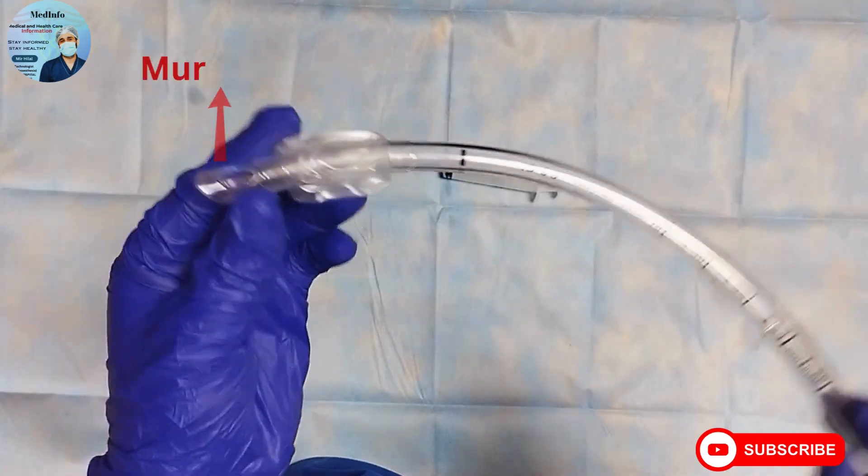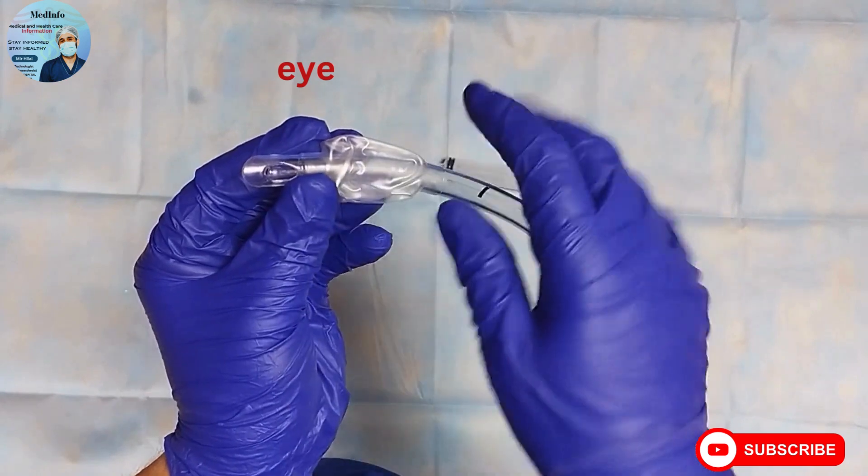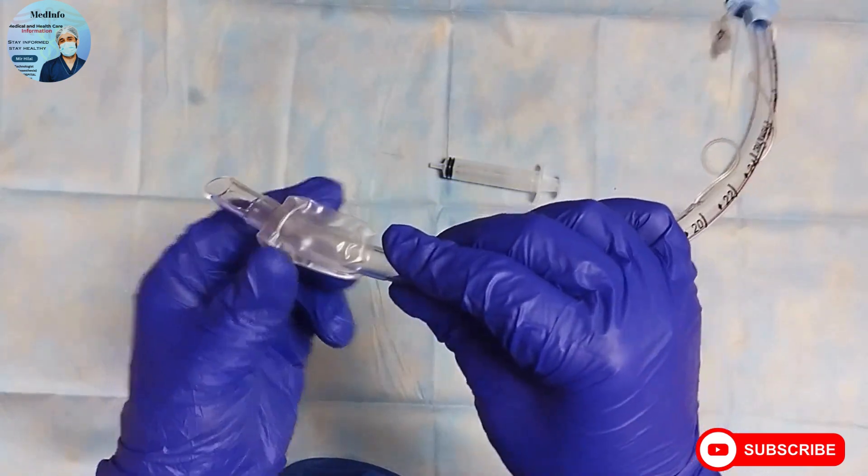PVC type endotracheal tubes contain an additional hole near the tip called the Murphy eye. So if the main lumen gets blocked, the patient can still be ventilated through this Murphy eye.